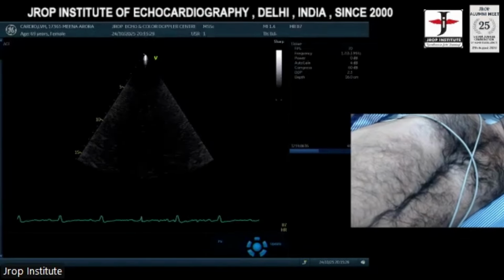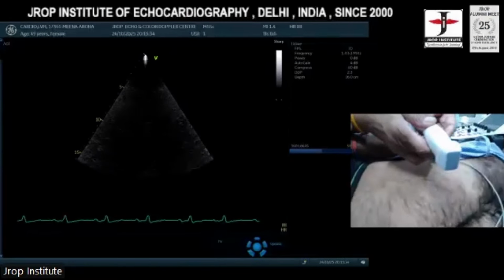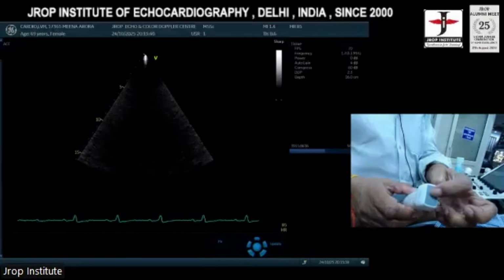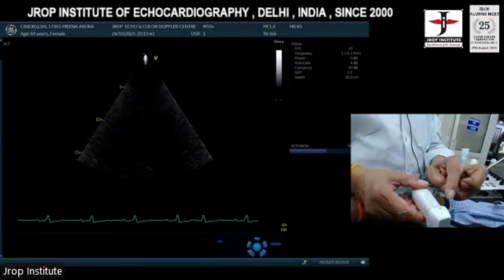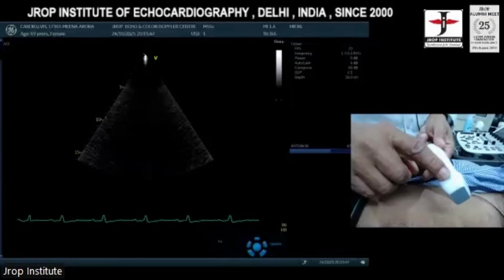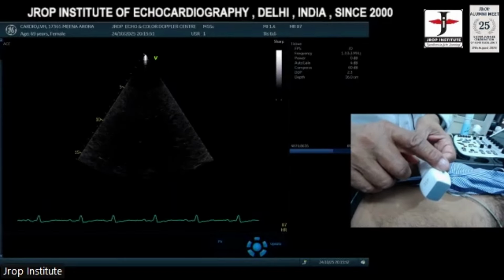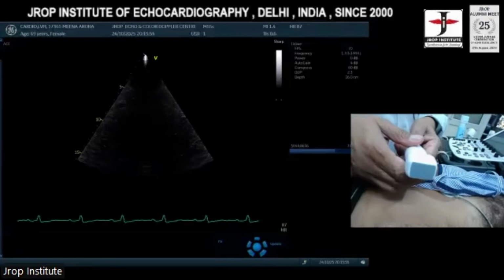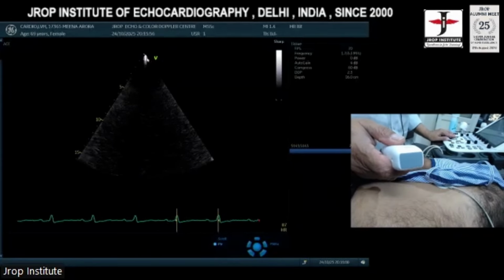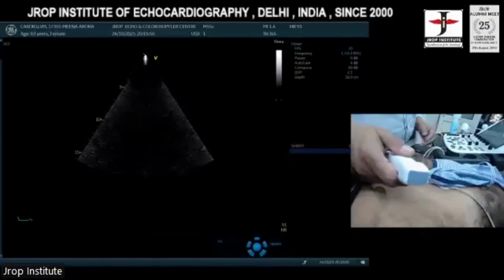Second comes the transducer. Look at this transducer over here. Can you see the transducer? Right. This is the footprint of a transducer. This is the mark of a transducer, the index marker, and on the other side there's one dot. So you have to look at your screen, which is the index marker. Look at the probe, where is the index marker? And an important thing: look at the right side of your screen, the letter V is written. If this is V, this is the correct formation of the imaging quality.